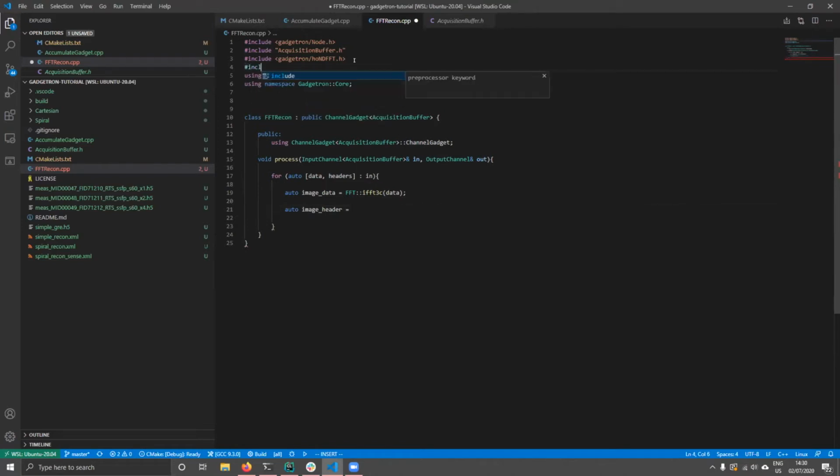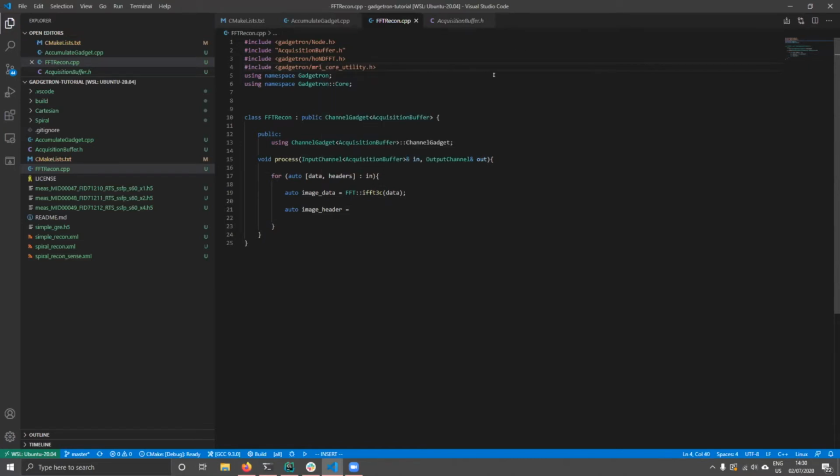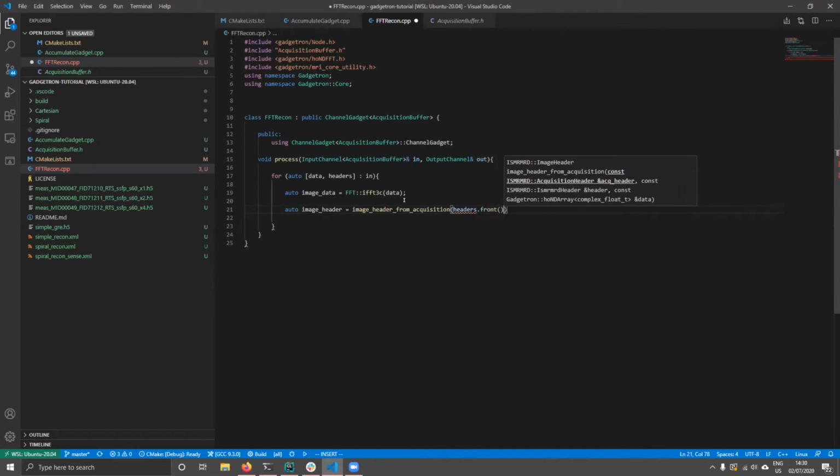But we would like to not have to write that image header by hand. And instead, we can just use this image header from acquisition method, which is why we needed the headers. Actually, we only needed just a single header. And I'm just going to use the first. Then we need the header for the entire data set, which is a variable on the channel gadget. And we need the image data so it'll know about the dimensions of the image.